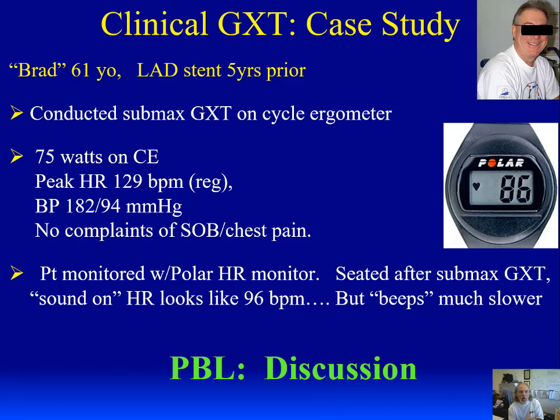Now, as I mentioned, he was monitored with a Polar heart rate monitor. I don't own any stock in Polar, but I think they're the best. The literature shows they tend to be the closest in accuracy in terms of ECG. Seated after the test, I always leave the sound on. And the heart rate watch, I've now taken it off his wrist, but it's just on the edge of my desk. That's so they don't go home with it.